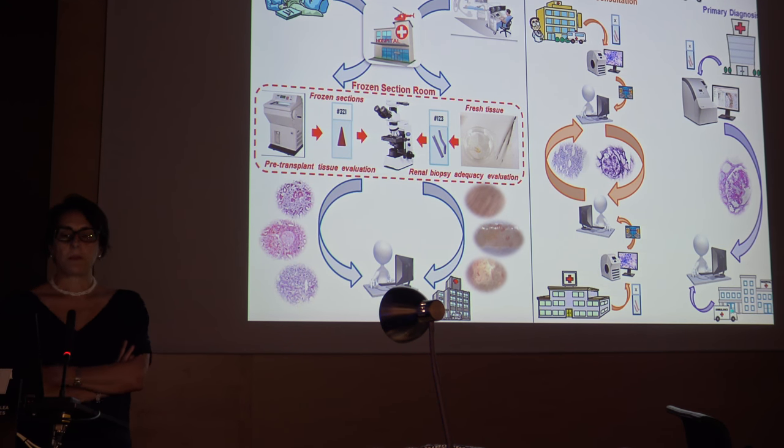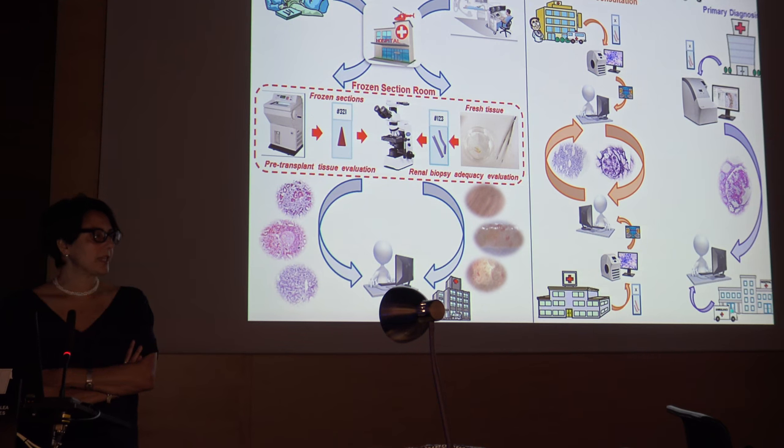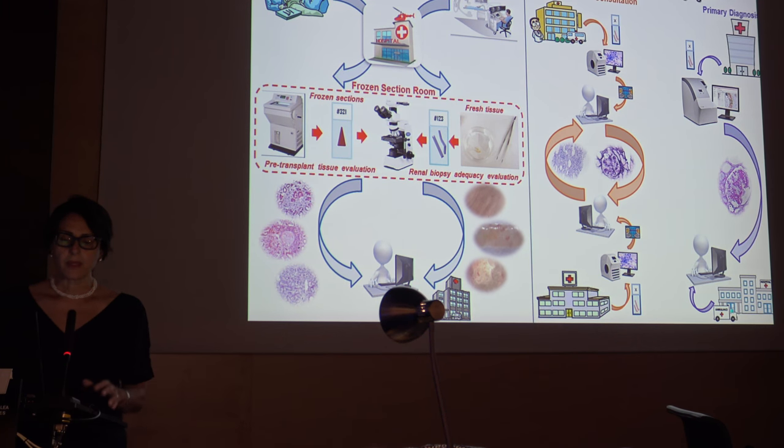Telepathology, when do we use that? Well, we can use it also for consultation. But the most practical use that I see today is, for example, for pre-transplant tissue evaluation. Very often kidneys are harvested in remote places where there are no expert pathologists. This is one application of telepathology. We can make better use of our expertise from a remote site and simply connect to the computer and assess the frozen tissue.